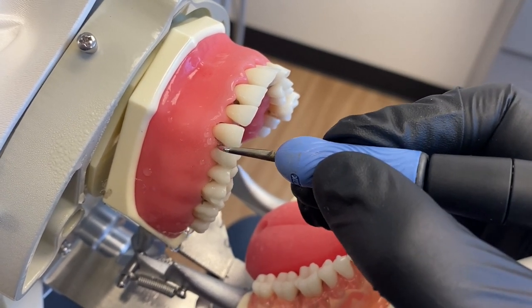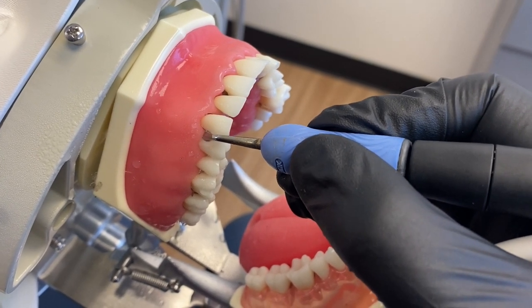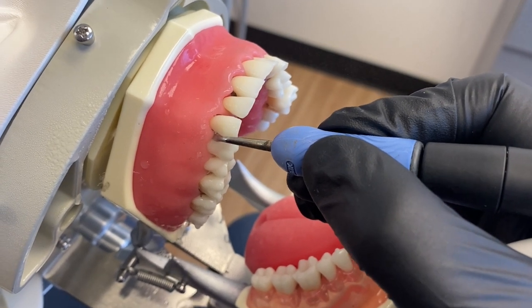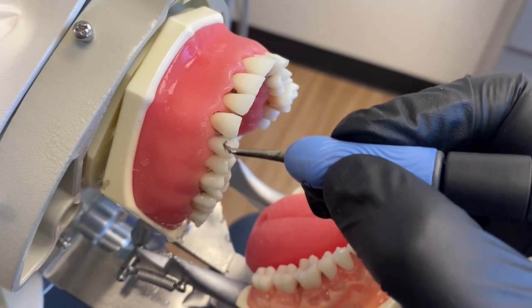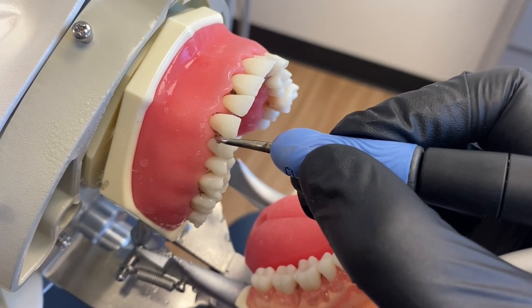Okay, looks like a lot of it came off there. It still feels like there's a little something down there — I might need to get a little bit deeper. Again, don't be shy. That took some time and that's okay. As long as your tip is in constant motion, that is the goal.